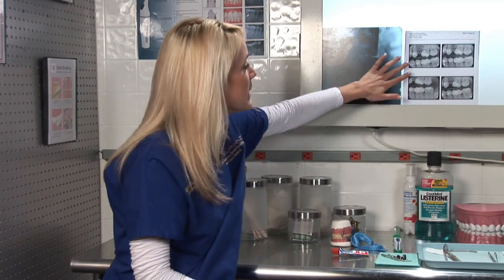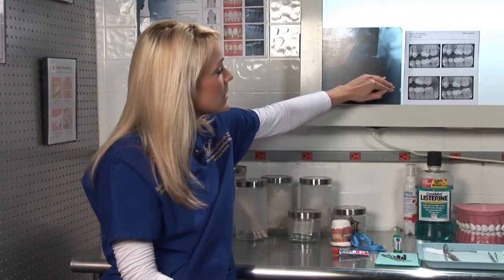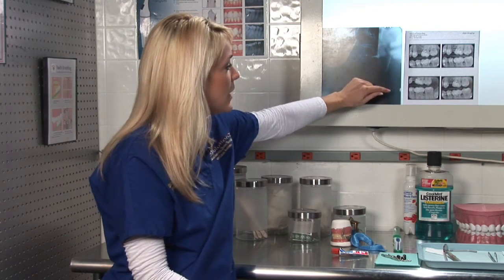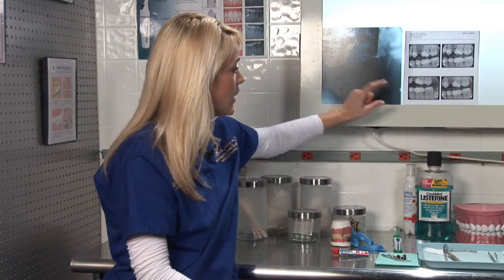Bite wing x-rays — if you take a look over here — they're a series. They usually come in a set of two or in a set of four, and they're great films to take in order to determine if you have any cavities in between your teeth.